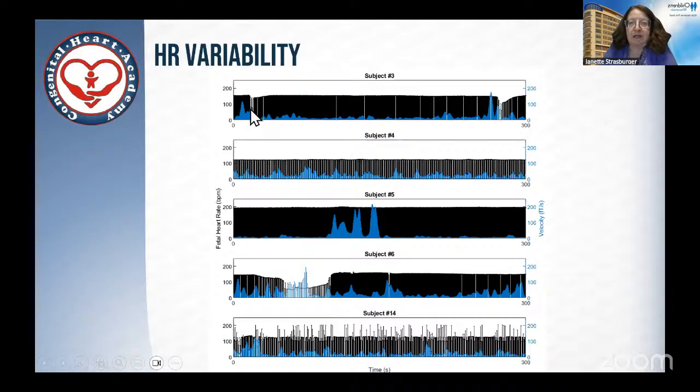You can see this is fetal activity. Normally you'd expect it to increase the heart rate, and it decreases it almost like a late deceleration. In this patient, you do see a very severe pathologic deceleration, but again, these are less than 30 seconds long, so they would be very hard to pick up by echo. This is a patient with sort of a persistent sinus bradycardia where all of these are very flat. You can see the changes are in the range of 4 beats per minute over long periods of time, which is really abnormal.